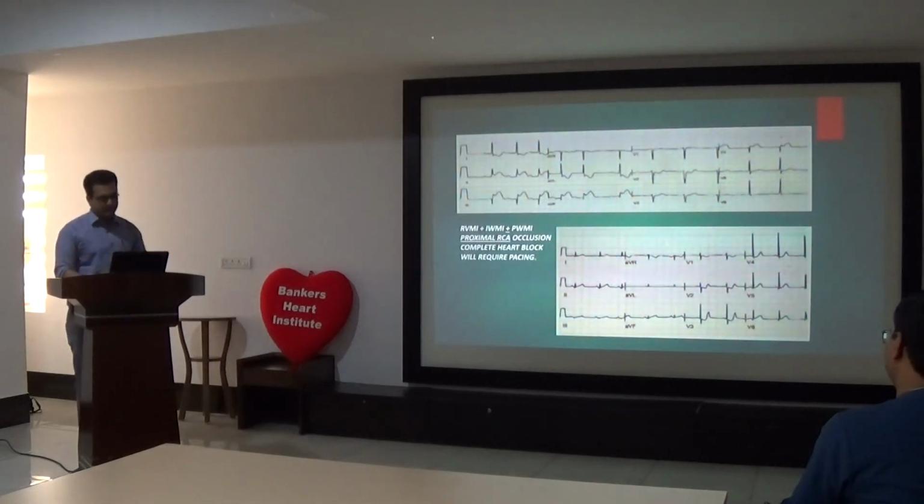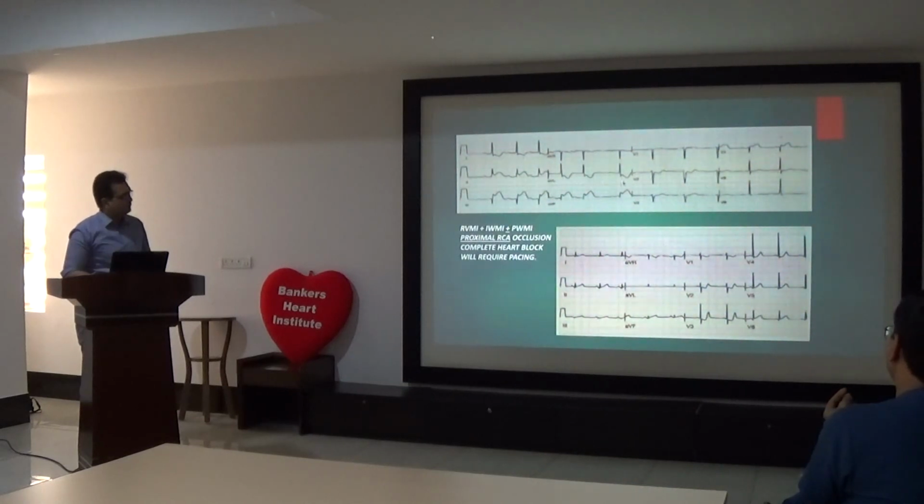Now this is an ECG of a patient, a post PCI ECG. How is it CHB? Sir, looks like Mobitz 2, but if we had the whole rhythm strip we would know more. It doesn't look like CHB even considering the pulse rate. P waves are there actually, even in the last V6 you can see P waves with the QRS.